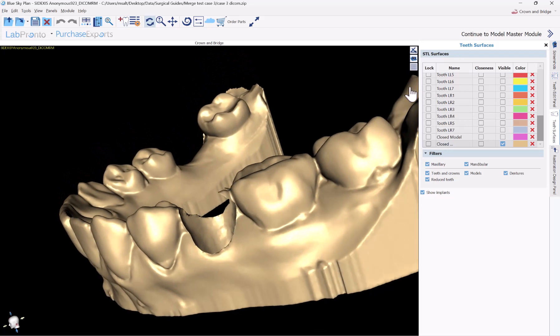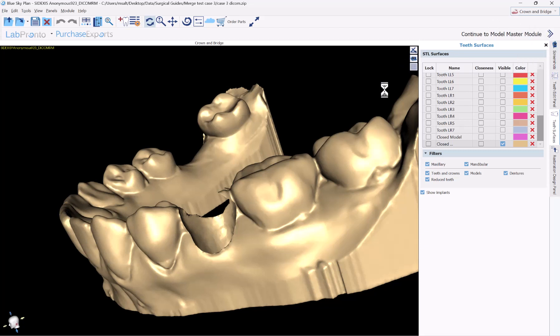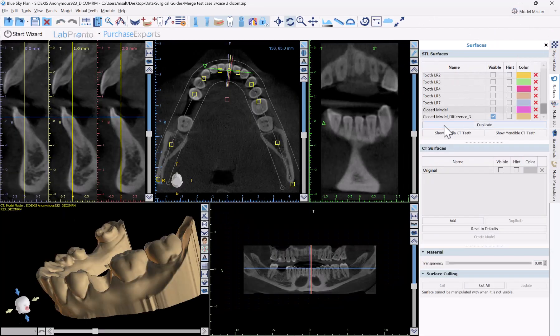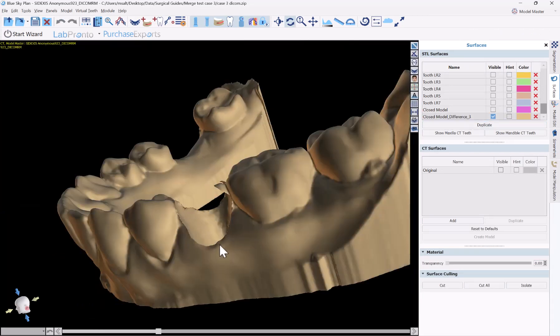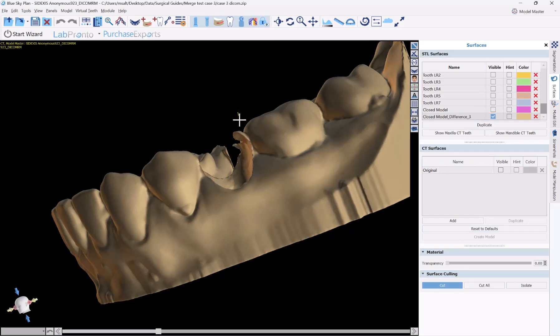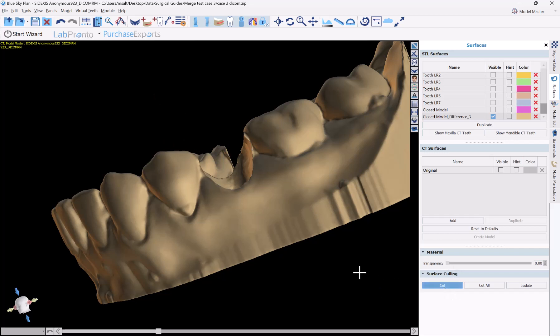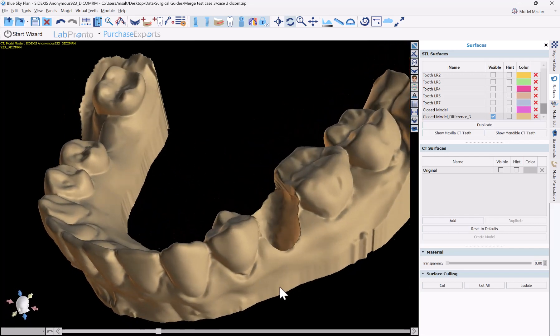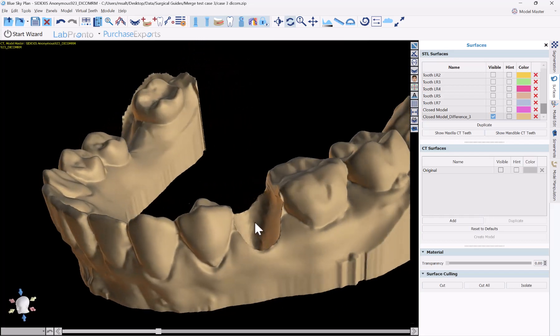We'll go ahead and clip those extra pieces away by switching back to our model master module. Here we select the relevant surface and make the 3D view larger. I'll use the cut tool at the bottom — activate it, hold down the shift key, and draw a lasso with my left mouse button to remove anything we want to remove. To turn off the cut functionality, click the cut button again or press escape. Now we have extracted the tooth and can see the emergence profile.